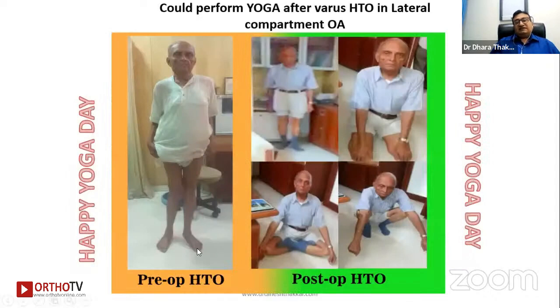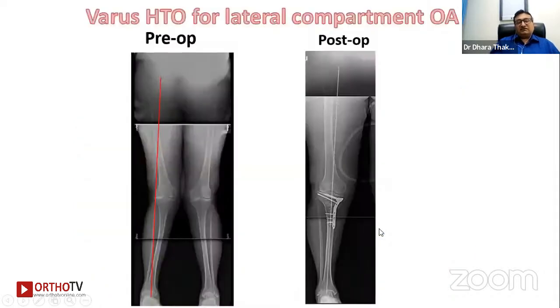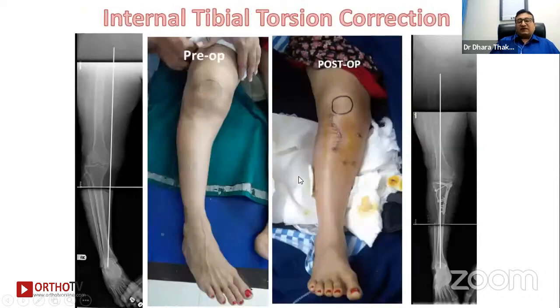Here is a lateral compartment arthritis. We can see valgus knee here. After surgery, the limb has been straightened. Patient can do Vajrasana, can even do Padmasana, and can squat also. And this was a clear X-ray picture before. This is lateral compartment arthritis. Weight-bearing axis has been corrected to the center of the knee joint, and he was able to do full function.